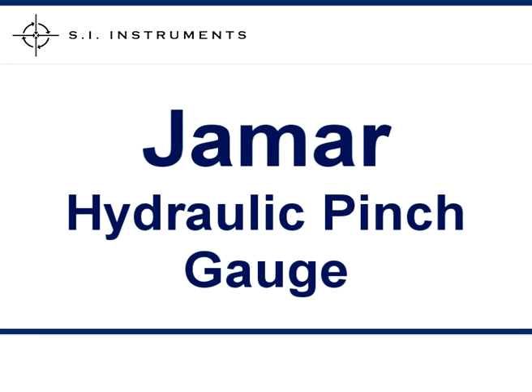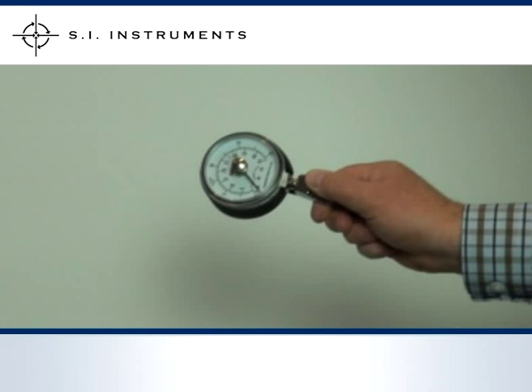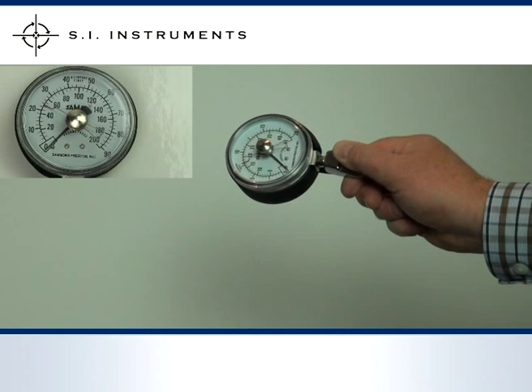The Jamar Hydraulic Pinch Gauge is designed to measure the strength of one's tip, key and power pinch. The dual scale allows for measurements to be conducted in both pounds and kilograms. Jamar's unique pinch block is specifically designed for even, comfortable pressure application. It operates in the same way as the hydraulic hand dynamometer, using the peak hold needle to automatically retain the peak reading.